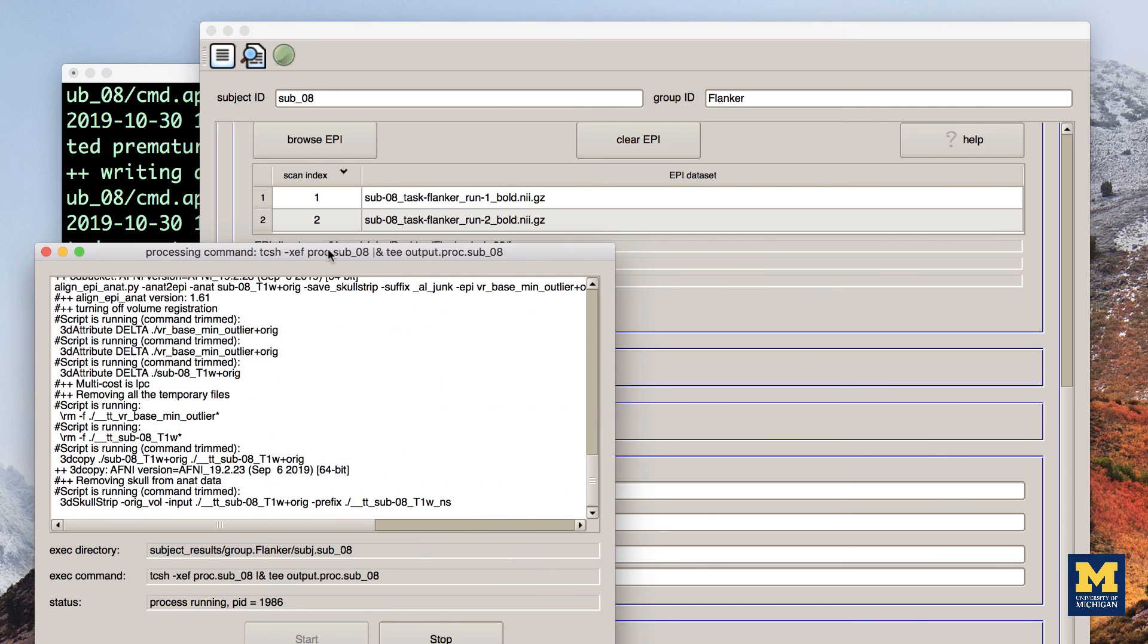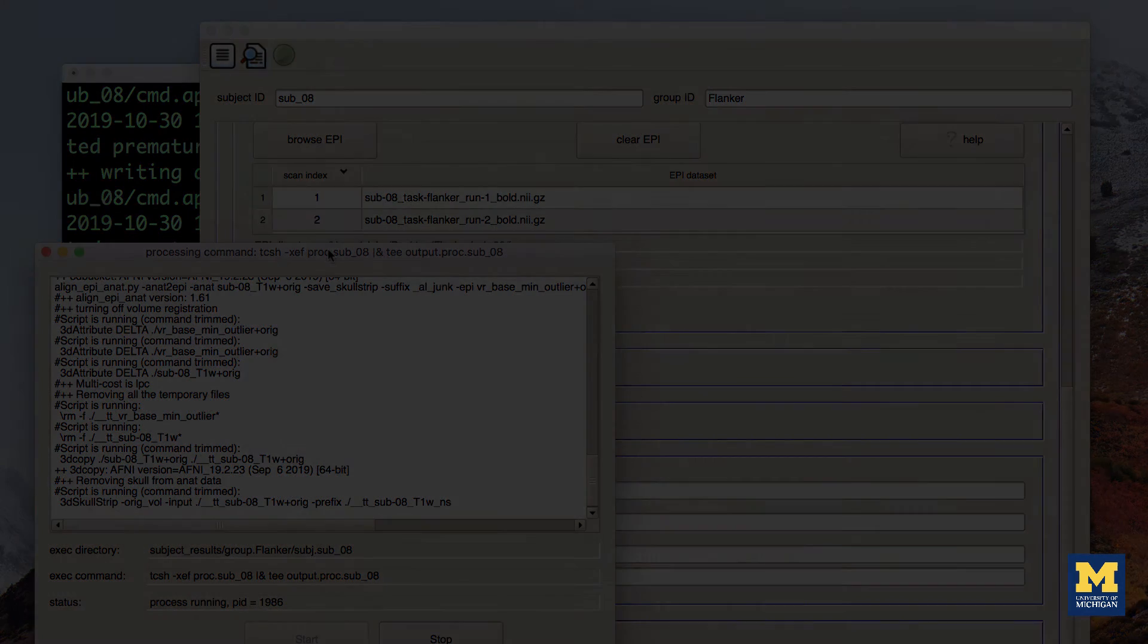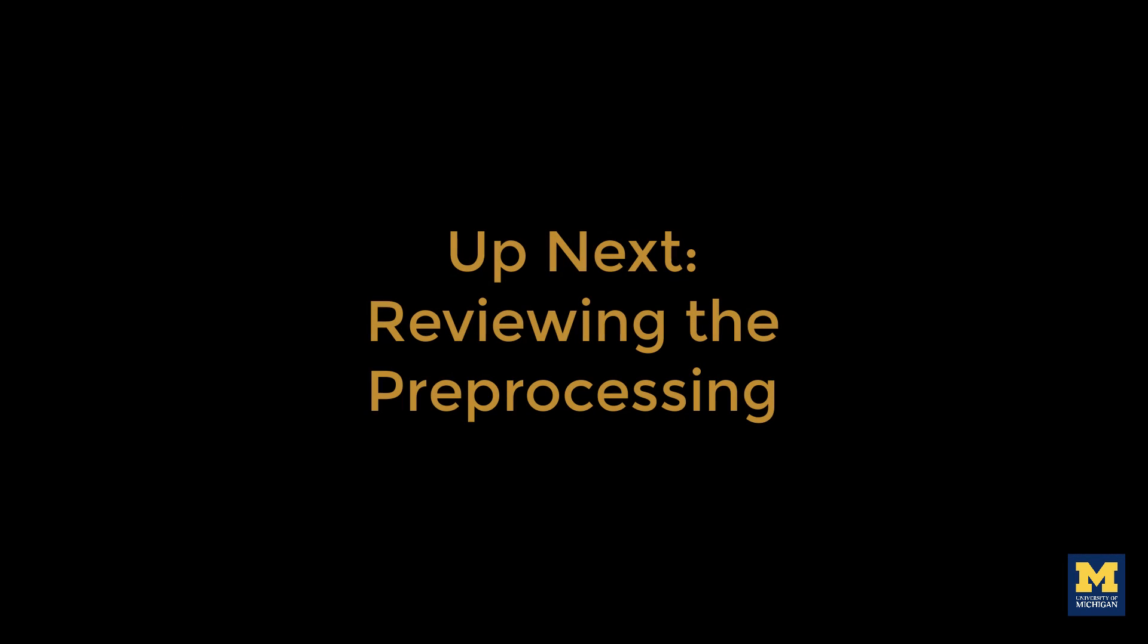Pre-processing will take about five minutes, depending on the speed of your computer. When it finishes, you will see the output files from each pre-processing step that was indicated in the processing blocks field. We now turn to reviewing each of these pre-processing outputs, evaluating their quality, and deciding whether there is anything we need to redo.